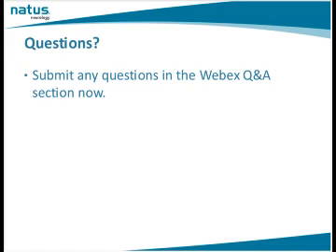Okay. Do you have any tips for identifying the ACA? Yes. I feel that the most important part of identifying the ACA is to pay very good attention to your waveform at the MCA-ACA bifurcation. So the way that you can be successful with that is, as I said, starting at a depth of 50, you'll have your middle cerebral artery flow towards the transducer.